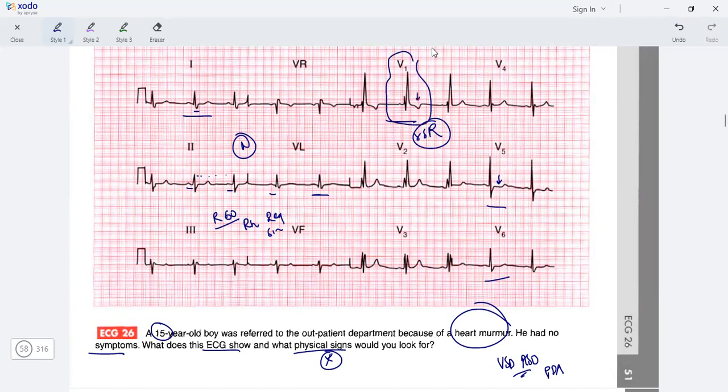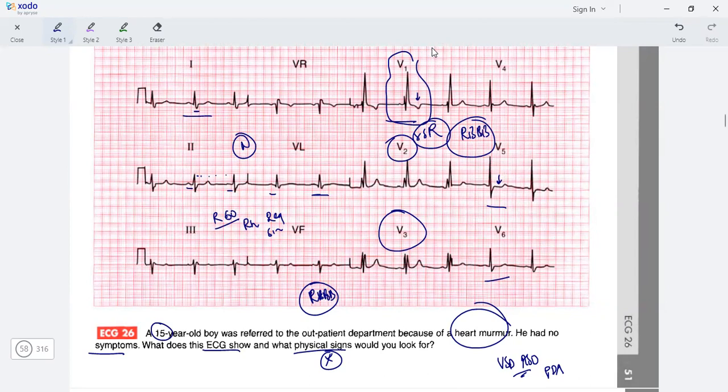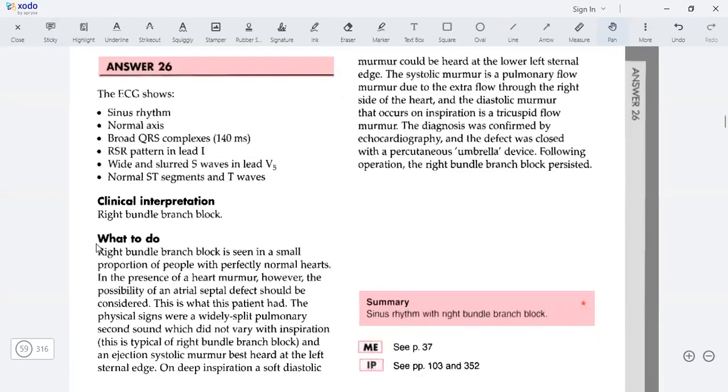Whenever you have RSR pattern with some widening of the QRS, plus ST depression and some T inversion, this is an RBBB pattern. You have normal sinus rhythm with RBBB pattern extending to V2 and V3. Whenever you have RBBB, you have evidence of right ventricular stress or overload, maybe due to ASD. The patient has a murmur and RBBB is a sign of ASD, especially secundum ASD, which often has RBBB. Our diagnosis is correct: sinus rhythm with RBBB.